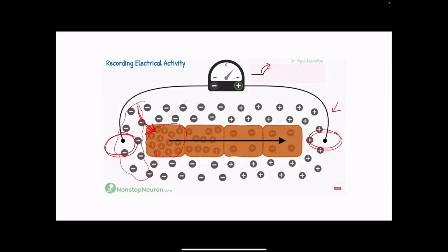This over here is connected to the positive, so this is our positive electrode. The wave of depolarization is going this way. You have positive ions entering in this direction, so the cells are becoming depolarized in this direction. This cell becomes depolarized first, then this cell, then this cell, then this cell. So the direction of depolarization is this way, okay?